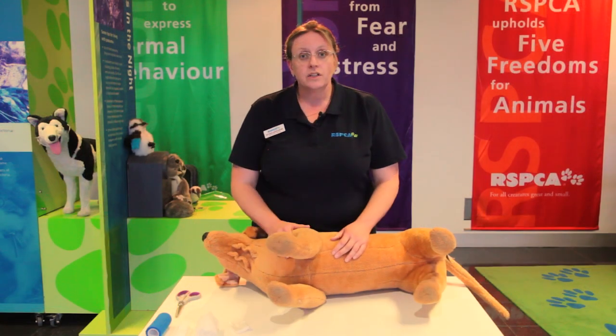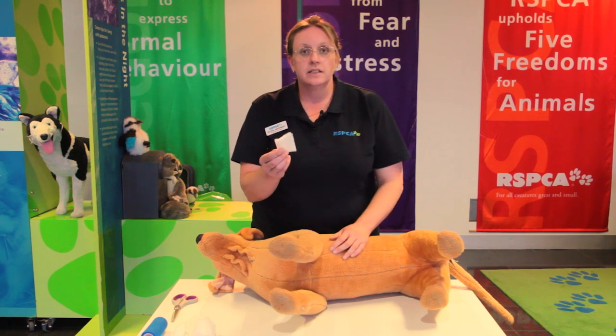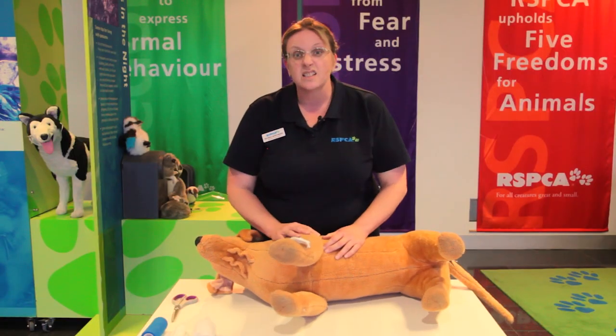There are a number of layers involved and I'll tell you what each layer is doing as I put it on. The first layer is a non-adherent or non-stick dressing — it has a shiny side and a soft side, and we place the shiny side onto the wound so that it doesn't stick.